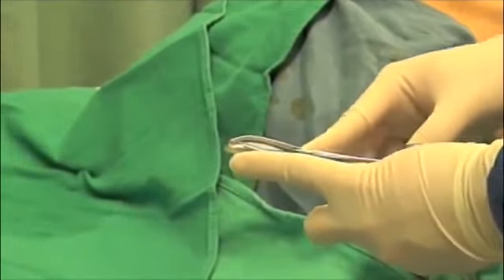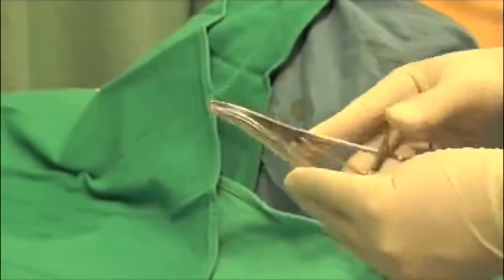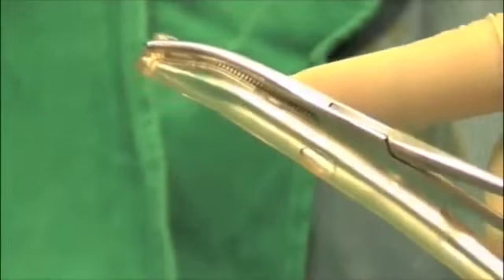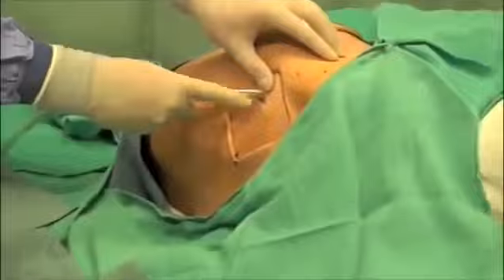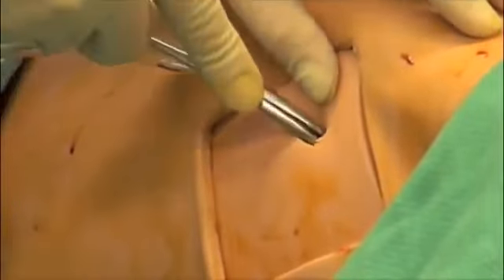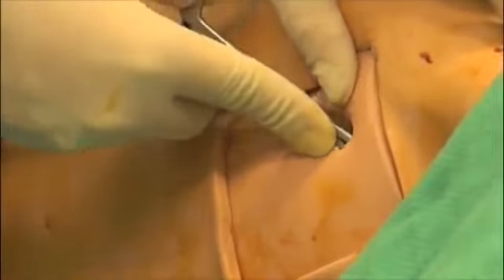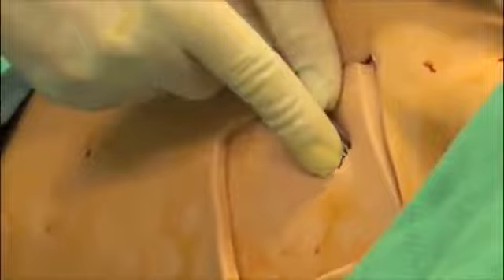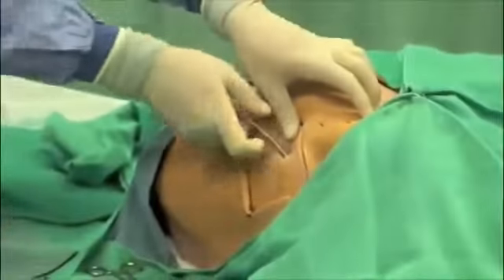Using the curved forceps, clamp the end of the chest tube with the drainage holes. Place the tip of the tube into the pleural space. If possible, you may use a fingertip to guide the tube insertion. Release the clamp and advance the tube superiorly and posteriorly to the desired depth.